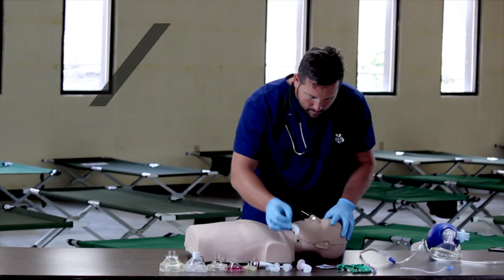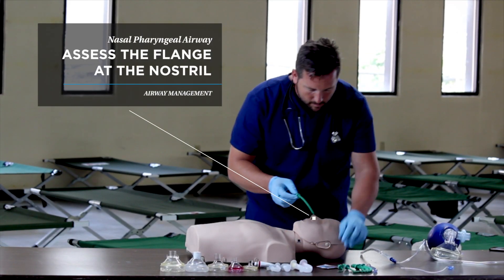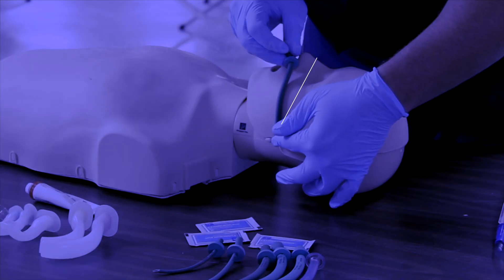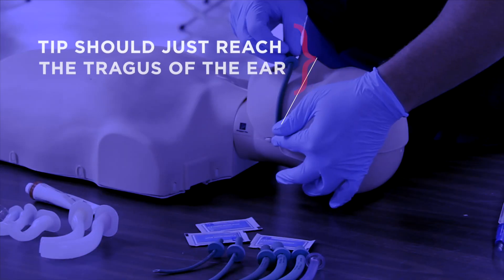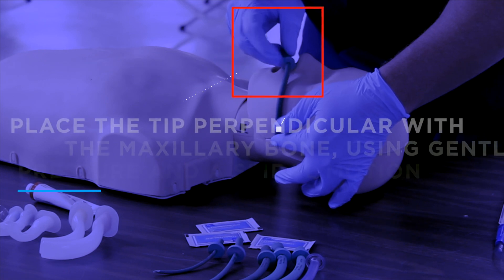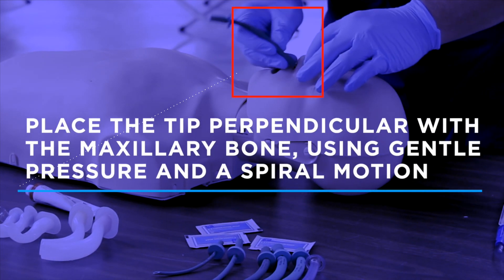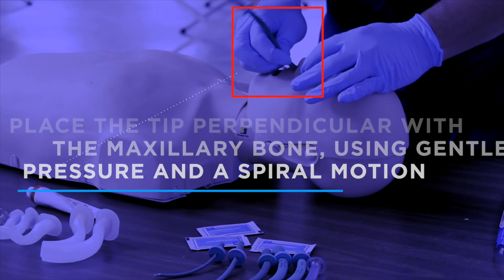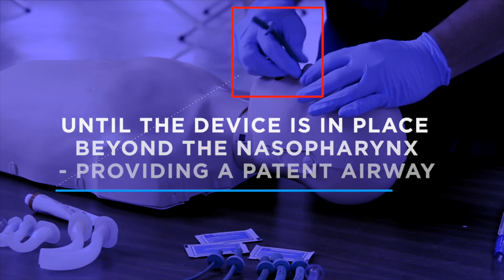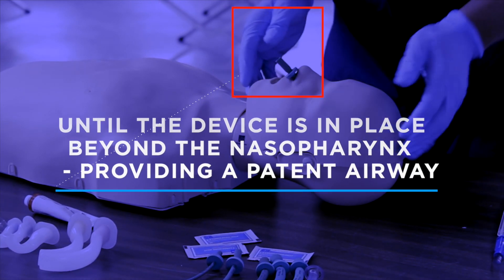Selection of the proper size nasal pharyngeal airway is done by assessing the flange at the nostril; the tip should just reach the tragus of the ear. To insert, place the tip perpendicular with the maxillary bone using gentle pressure in a spiral motion until the device is in place beyond the nasal pharynx, providing a patent airway.